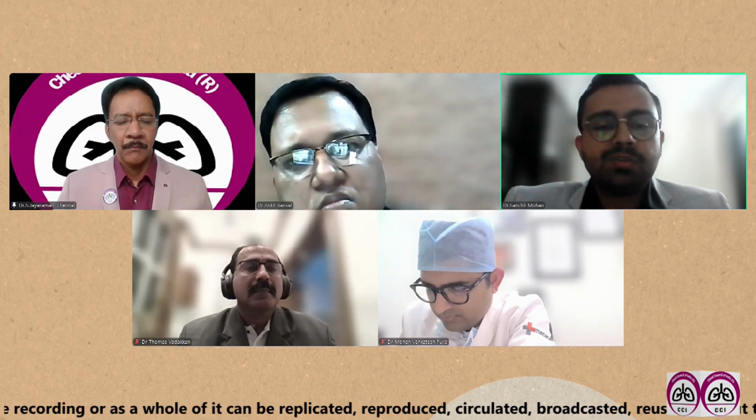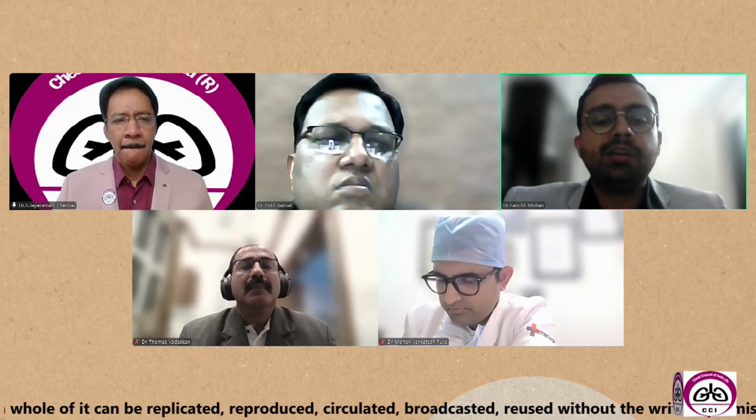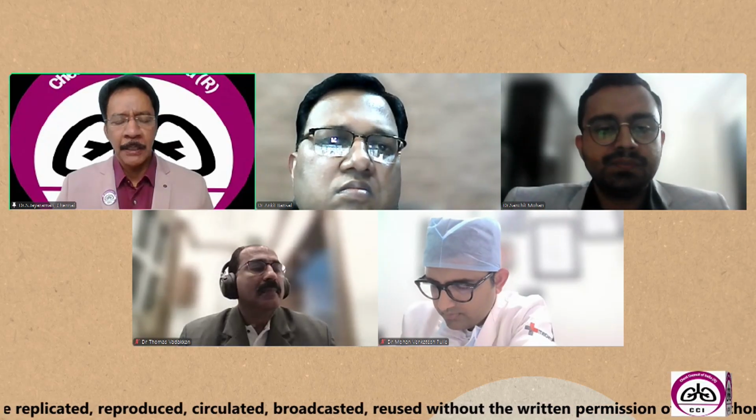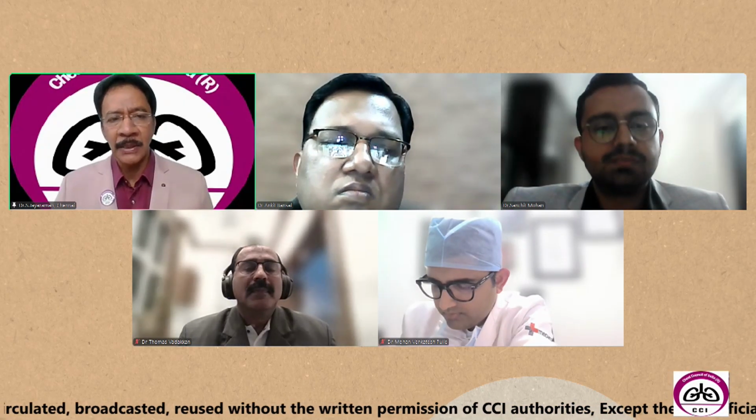So this is for the diagnostic EBUS. And if we are doing a staging EBUS, obviously we have to start from the N3 node first, then go to the N1 node. So this kind of path, based on diagnostic, therapeutic or staging purposes, you can take.